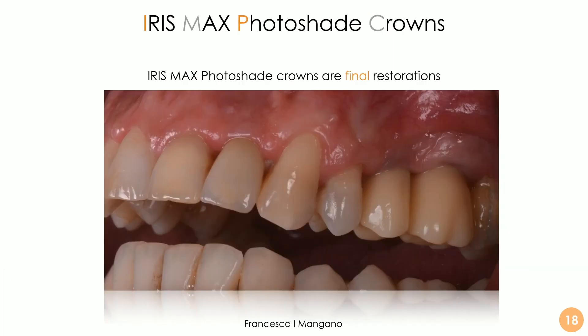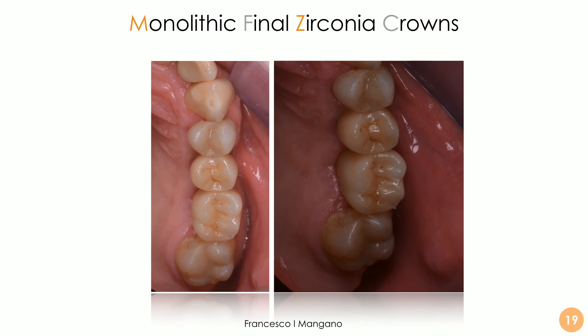We cement the individual hybrid abutment extra-orally over the titanium base, then screw it in place. We then finalize the case by delivering the Iris Max photo shade crowns as the final restoration. These can be considered final restorations because of their properties, their color, and their translucency. They are hybrid ceramics and can serve as definitive final restorations, or can be used as long-term provisionals before being transformed into something else — for example, monolithic zirconia crowns.